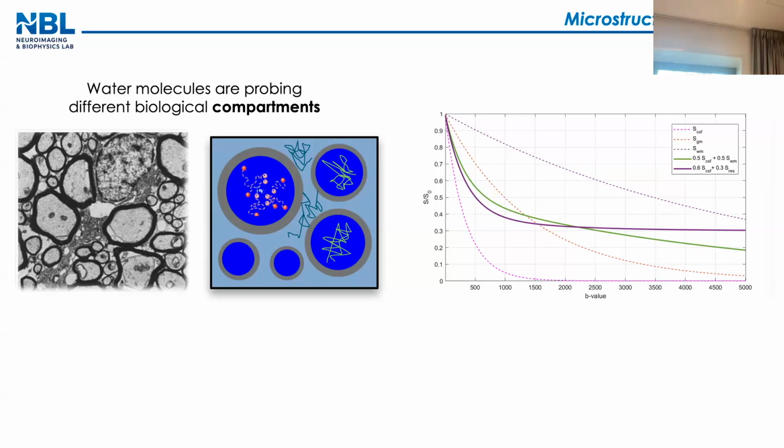Which means if you look at the signal at different b-values, it just follows a simple exponential decay. So if I want to characterize this exponential decay, I just need one number on this line. By knowing the b-value and the line, I immediately get the diffusivity. There is no other combination because it's a single exponent, and I can get the D from a single measure.